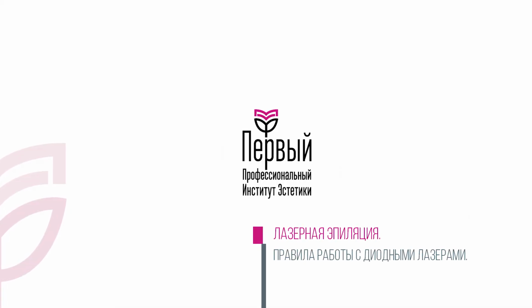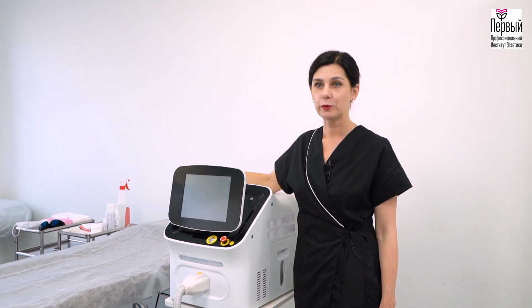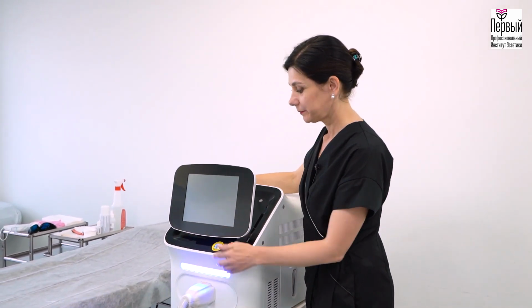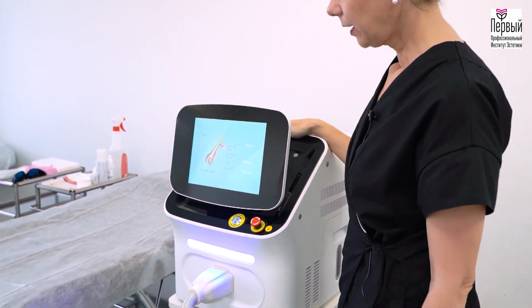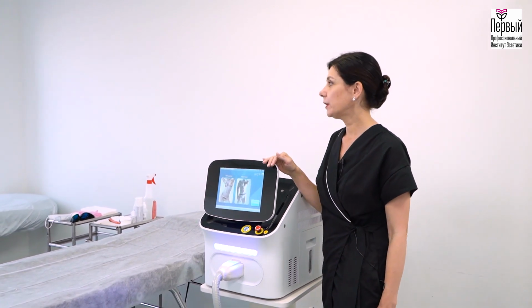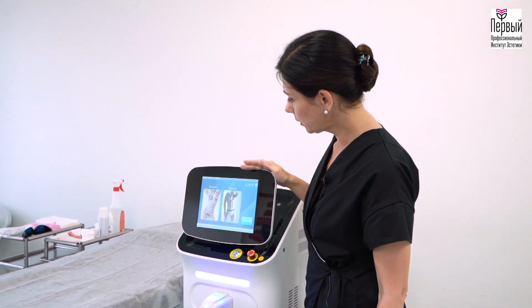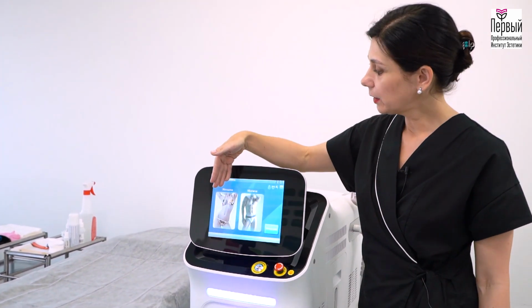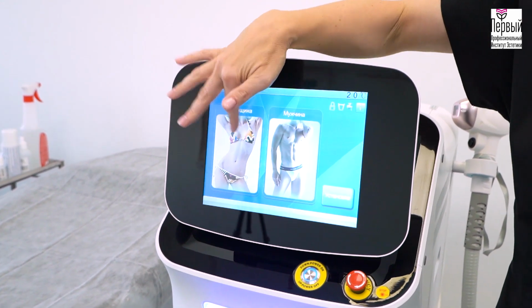Laser Epilation. Diode laser operating principles. We press the button to switch on the device. Some devices can be switched on by turning the key. The interface pops up. The device performs the self-test and pictures of a man and a woman are displayed. We click on one of the pictures to display the epilation areas.